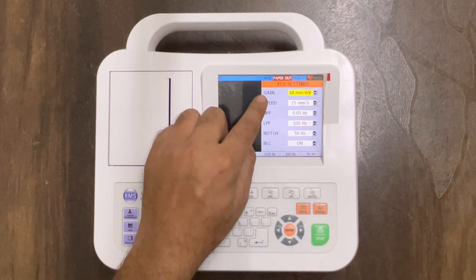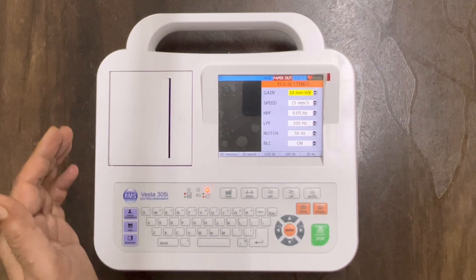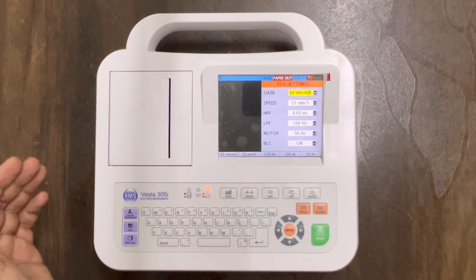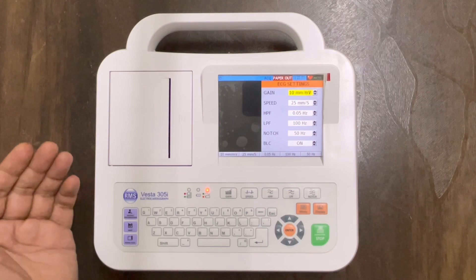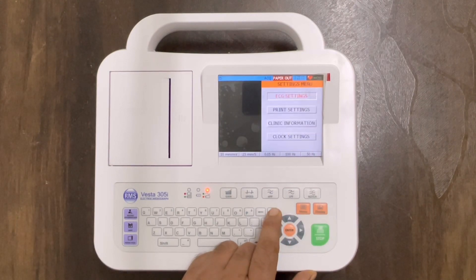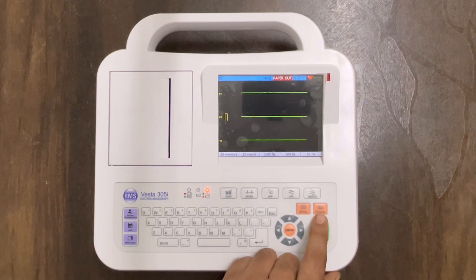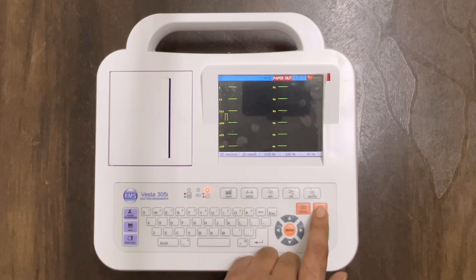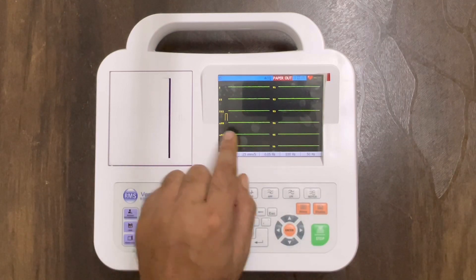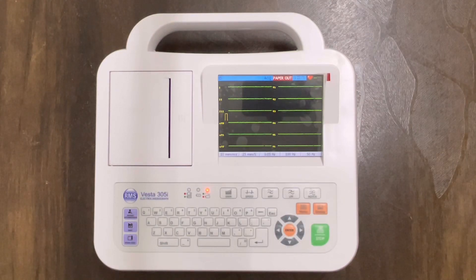Now go to ECG settings and press enter. These are all filter settings — we can keep it standard for diagnostic range, and only change the settings if using in ICU. Press escape two times and go to the main screen. Now we will change the display formats. I am selecting the 6 into 2 format because in this format we can see all the waveforms at one time.